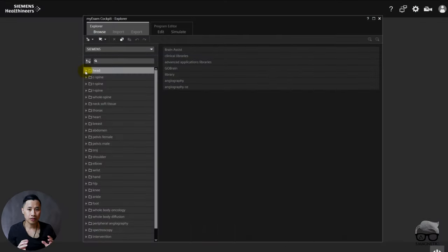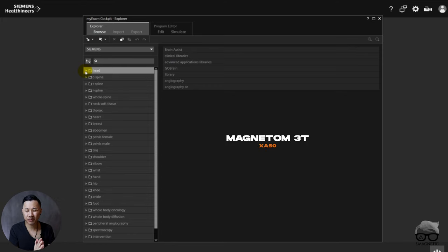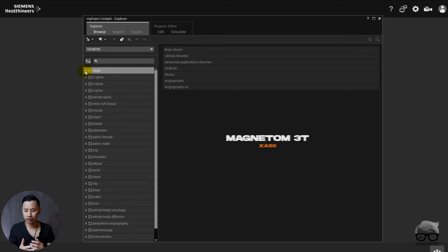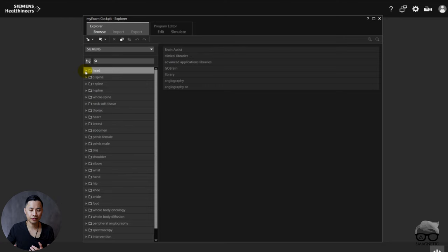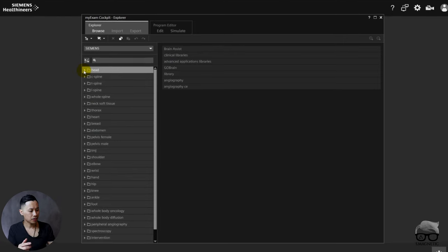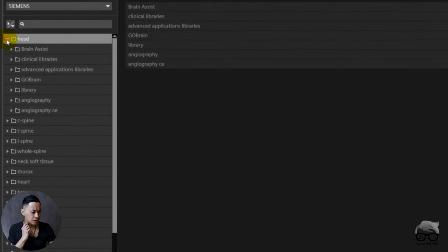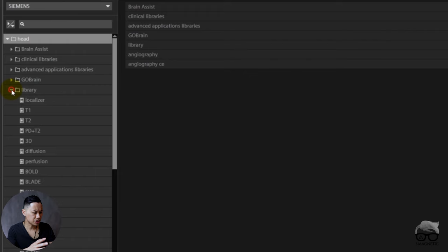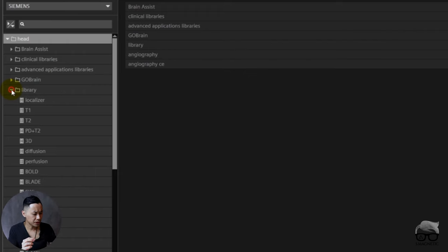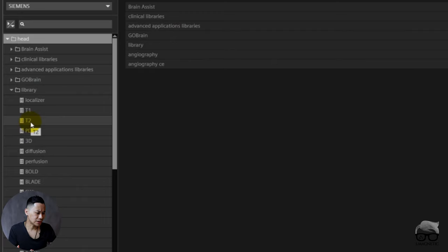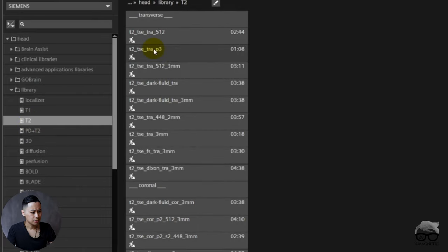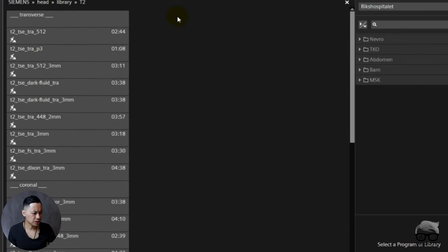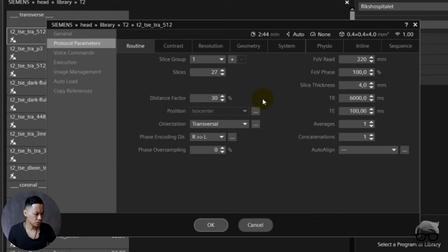Alright, we are currently at the 3T but it doesn't matter. Concatenation works across field strengths and across vendors. I'm going to show you a simple sequence here. We go into geometry. I'm going to show you a 2D turbo spin echo. Let's choose T2-weighted so it'll be easy for me to show you. Let's go to edit mode and then we will go to T2 and just open this sequence right there.